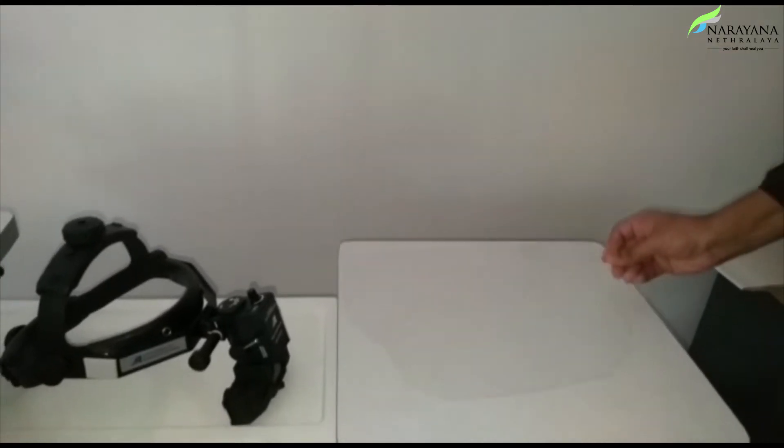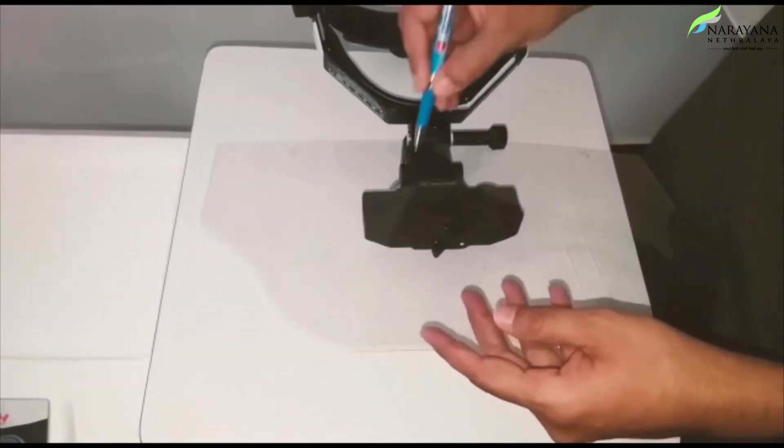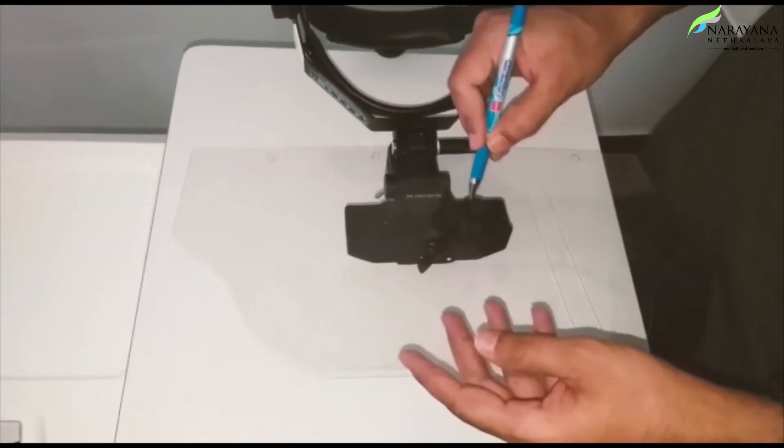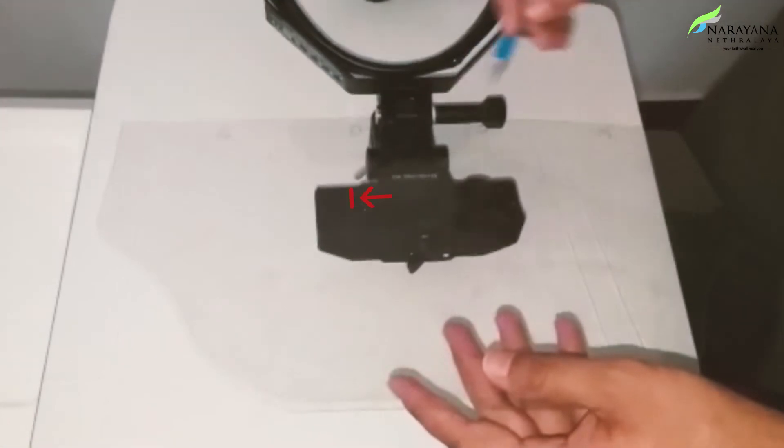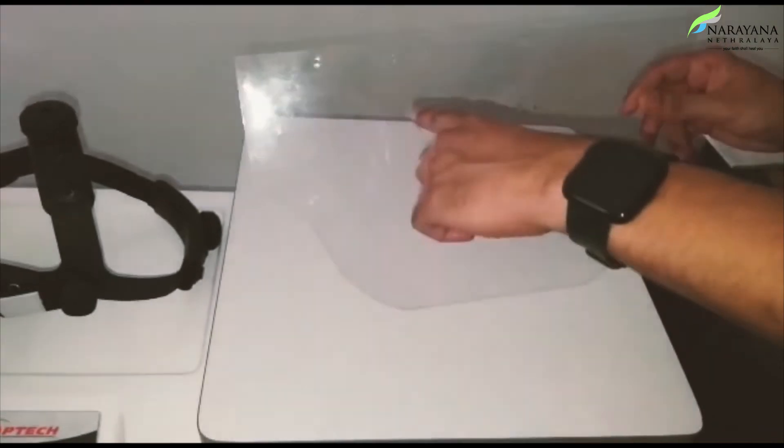Take a transparent OHP sheet, cut off the sharp edges, and place it over the eyepiece of the IDO to mark the height and width. The width can be made larger to allow for IPD changes. Cut out the marked portion.